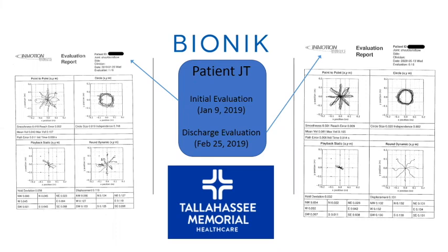It also makes it really easy to do what Sue did and send them off to an insurance company to say, hey, this is the improvement this patient is getting. We think that it's worth your money to actually improve this patient even further, which of course Sue was successful with, which we absolutely are quite happy.